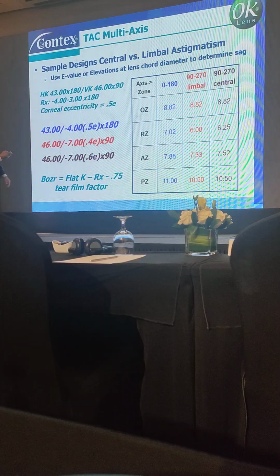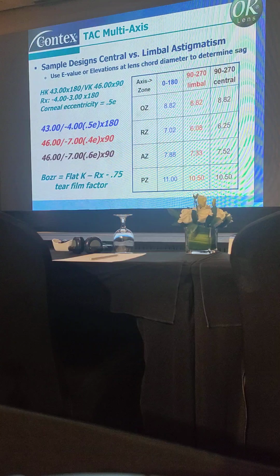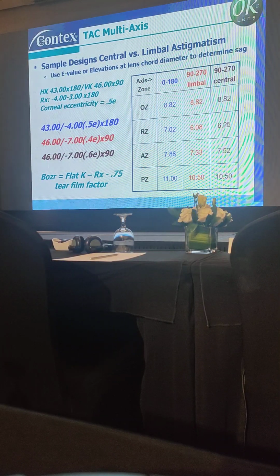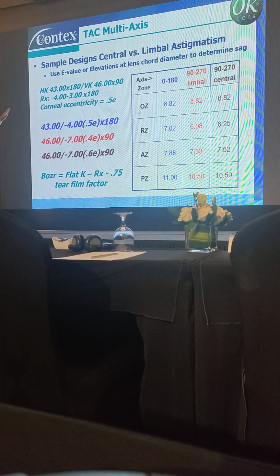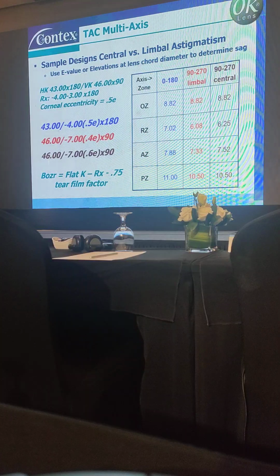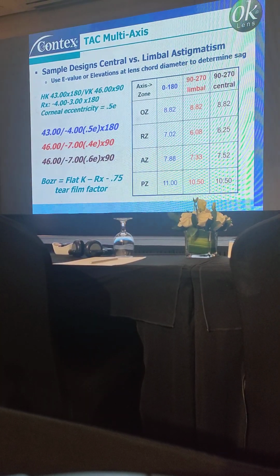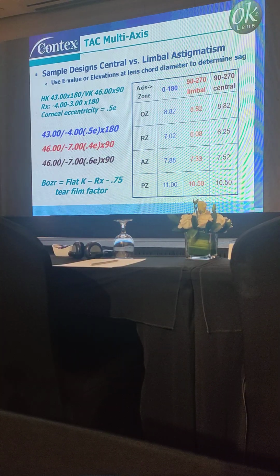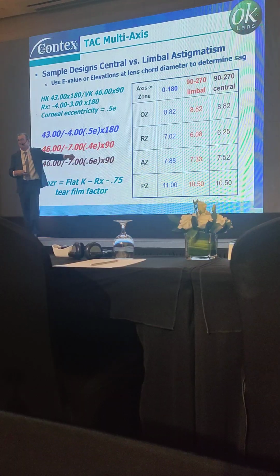Then you look at the 90 axis, you've got a 6.08, right? Because the 90 was steeper. Remember up top, it was steeper on the map. So we've got a 6.08 there with a 7.33 alignment curve, but then when we go down to, look at, that's a mistake, that should say axis 270.